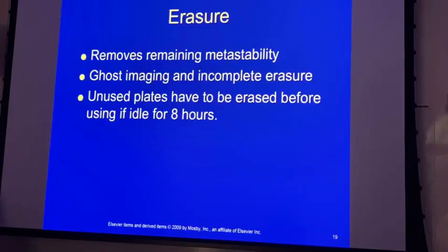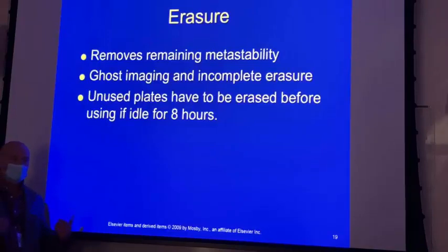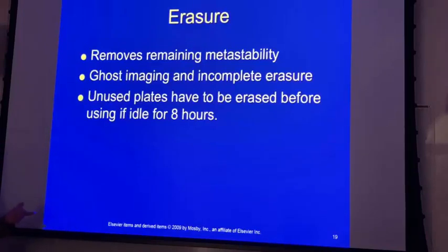If you don't have an eraser bank, then you process your image, take your image receptor back up to the floor, and shoot another chest x-ray on it, what you're going to get is what looks like a double exposure, okay? Even though the first image has been lifted, it's still going to look like a double exposure on the image receptor.